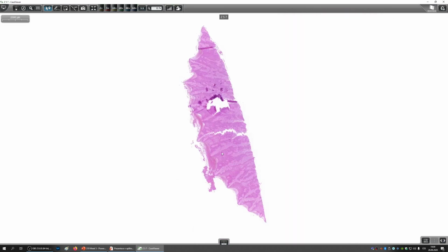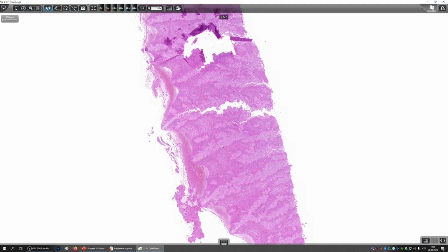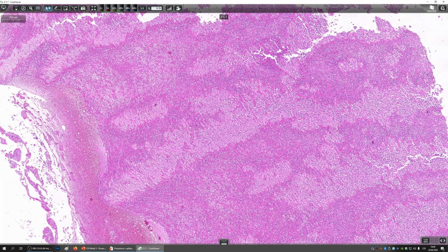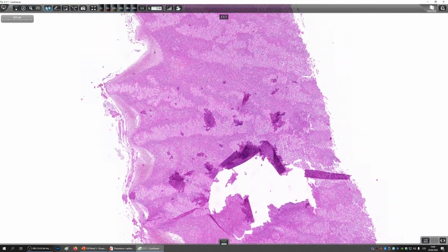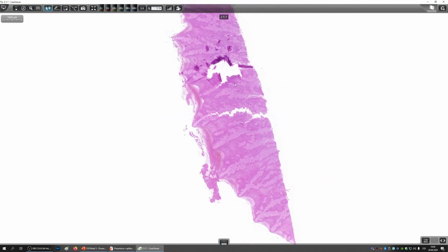So they say that a thrombus can develop in the arteries and also in the veins. In a venous thrombus, which develops over a certain time, you can have these lines of different consistency, lines where you have more and less fibrin and inflammatory cells. On macroscopy, these are the lines of Zahn. Z-A-H-N, lines of Zahn. This is just something nice. So this developed in a big vein, most likely. And this is just gradual development of the thrombus layer after layer. This is still a relatively fresh thrombus.